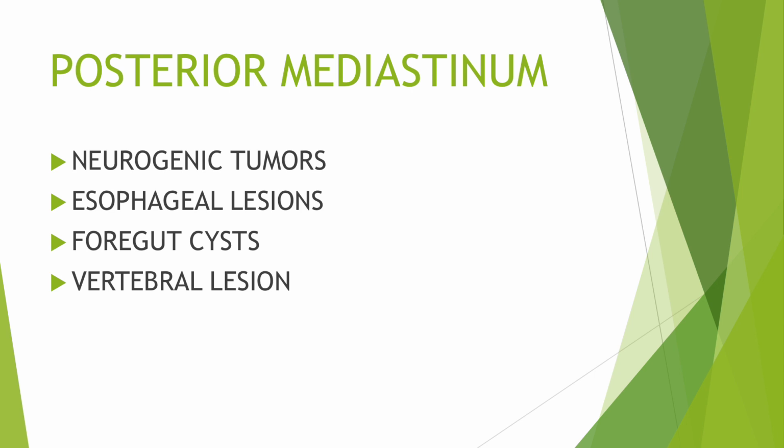I leave to you to read on pulmonary infections, diffuse lung diseases, airway diseases, and the pleura, the chest wall, and the diaphragm. I've also presented to you examples of these diseases in the first study.